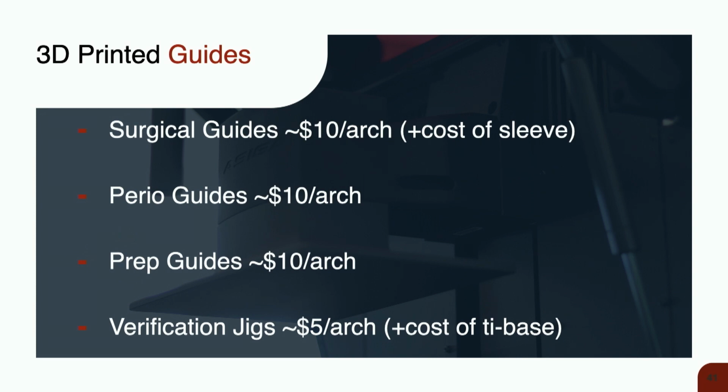It gives you, number one, better results, because their preps are going to be much closer to what you actually need in terms of space. But also you can charge them a little bit for it, right? So that's a great way to kind of bump up the lab bill a little bit.